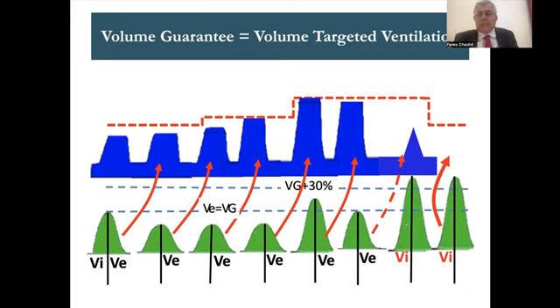So during the inspiration, we don't wait for the expiration. If the volume taken exceeds the volume guarantee by 30%, then for safety, the machine will order the breath to stop, the expiratory valve to open, and the pressure will be dumped. If you look at the pressure graph, you wouldn't find it rectangular as it usually is, you will find it triangular.